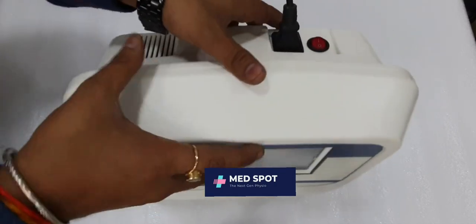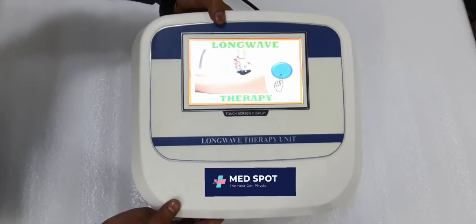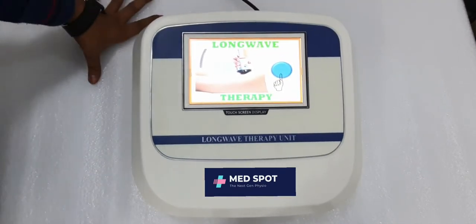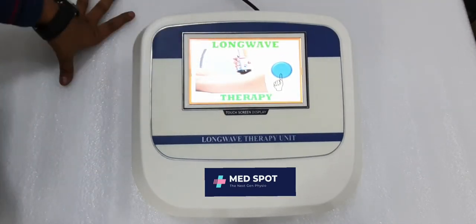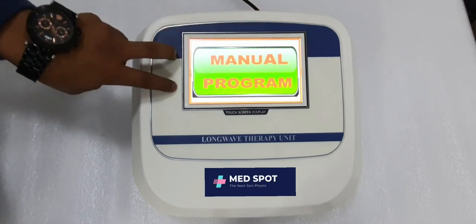Here's the button over the socket — you need to press it on the right side. After that you can see the long wave therapy unit has started. Simply press that button.